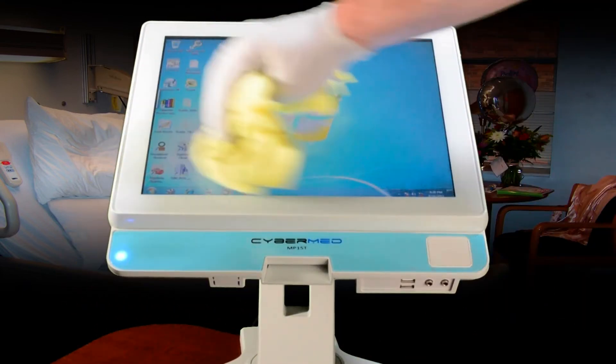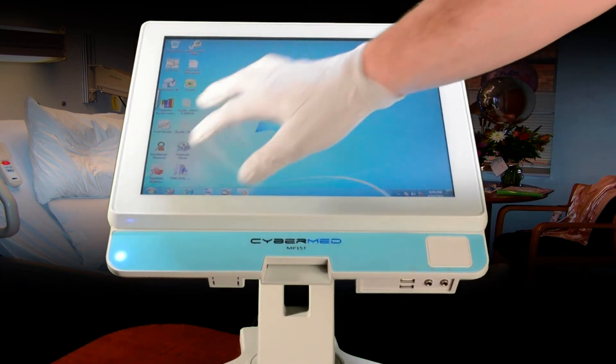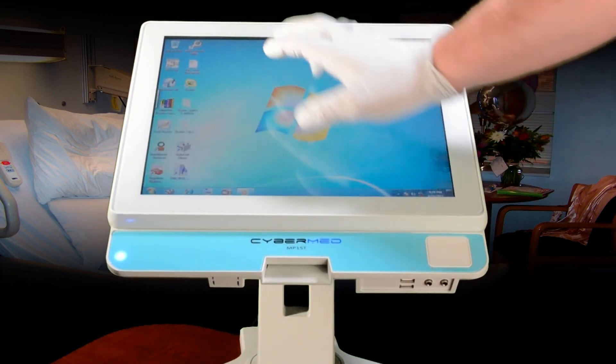In this demonstration, the user is able to resume using the touch screen PC immediately after cleaning it.